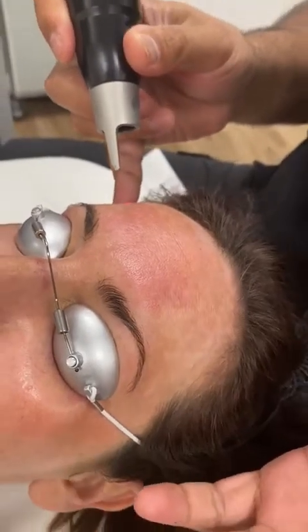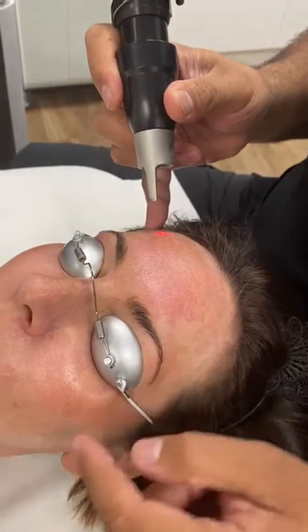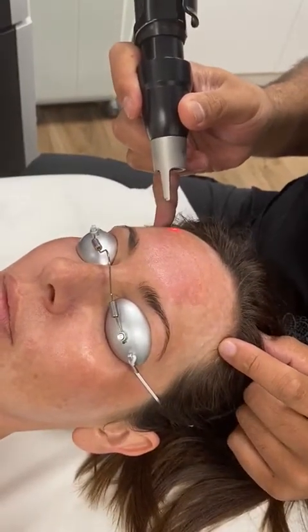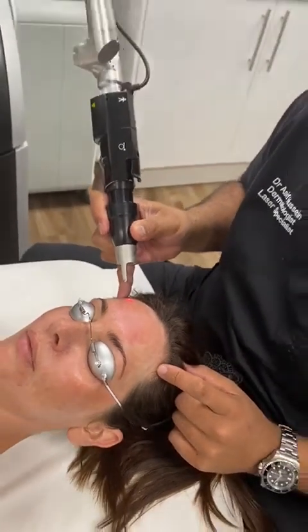What we're going to do is treat this pigment, and then within a few weeks she'll pop back and we'll have a look. Eventually we'll also do some treatment for the vascularity as well, and hopefully reduce this quite nicely — and we'll show you some nice before and afters.